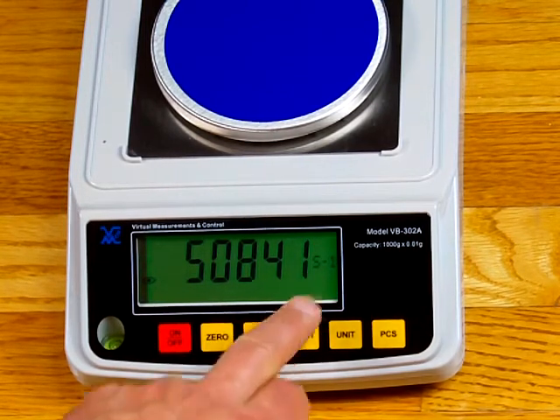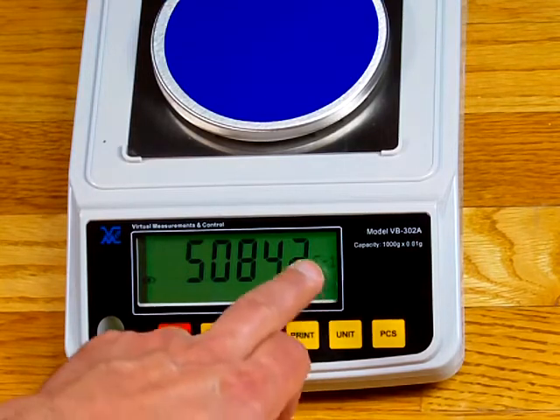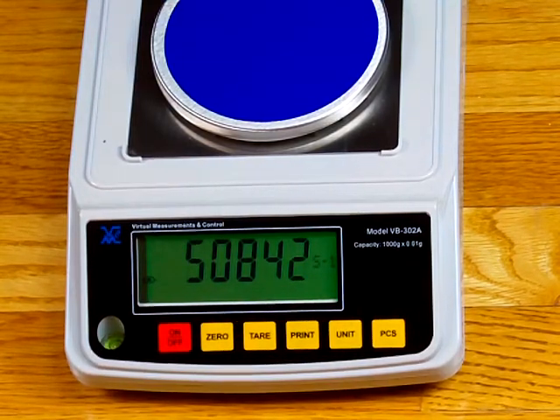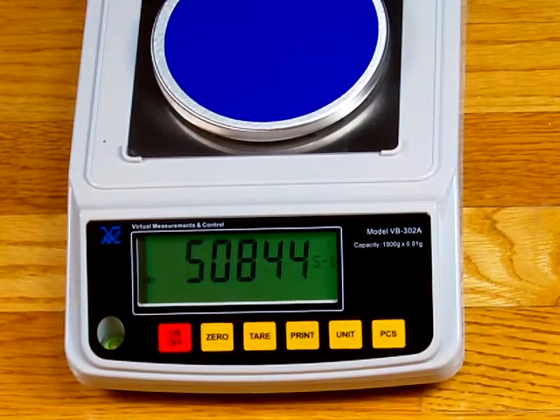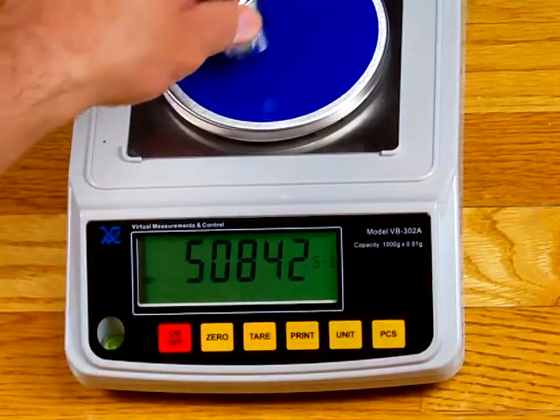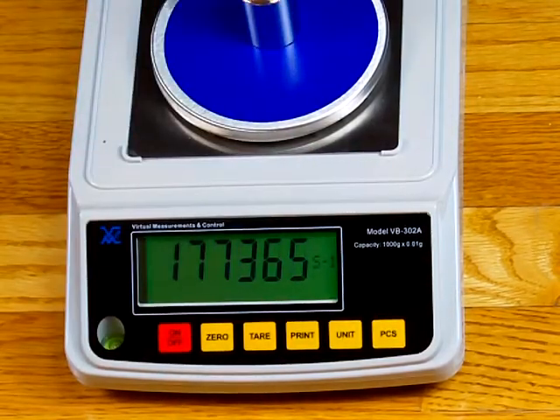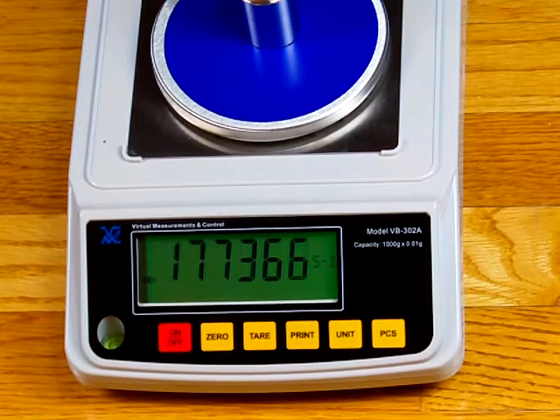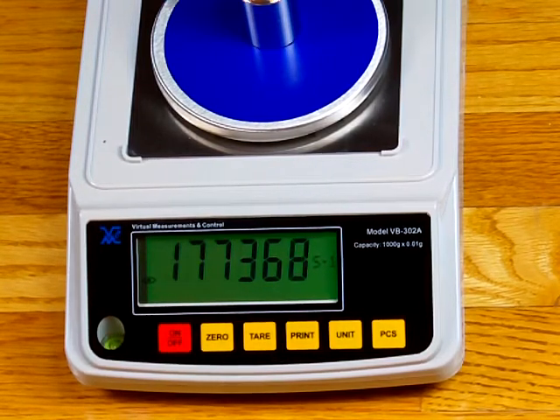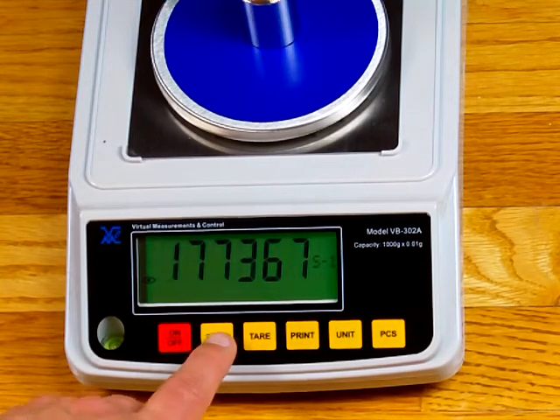And you'll notice now on the right-hand side, it says S-1. So it's looking for the first 200-gram weight. So I'll place the 200-gram weight on here. And again, these are random numbers coming out of the A to D converter. And once I have stability over here, I'm going to press the 0 key again.